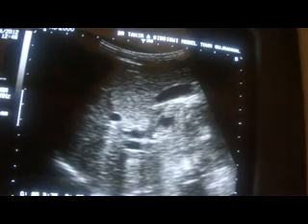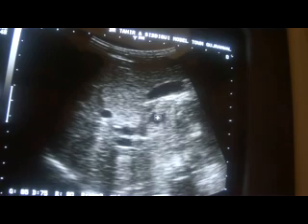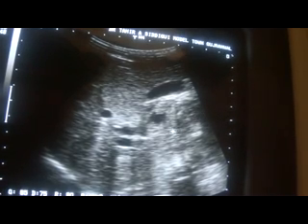If you see that this communicates — this cystic area with internal septations, these lines are septa. This cystic area is the same as this cystic area, from different scanning angles. It becomes continuous with the common bile duct. You see, this is the CBD. This is the CBD. This is the portal vein.